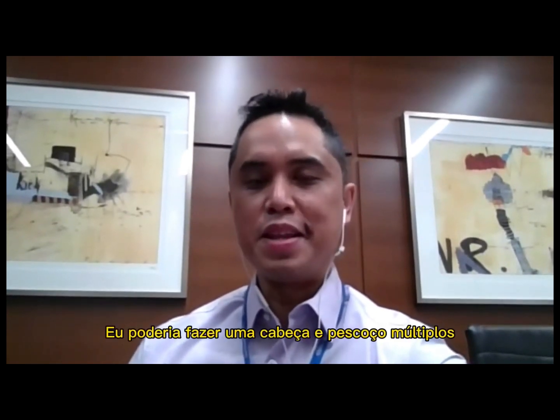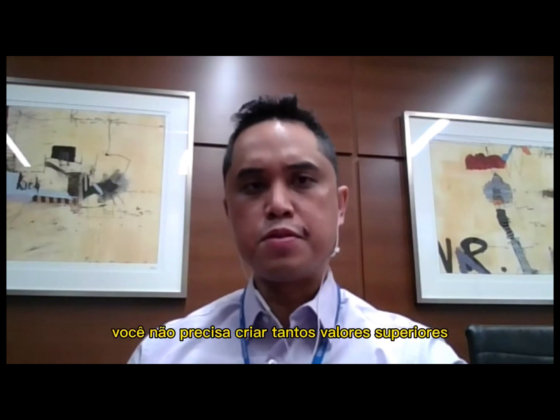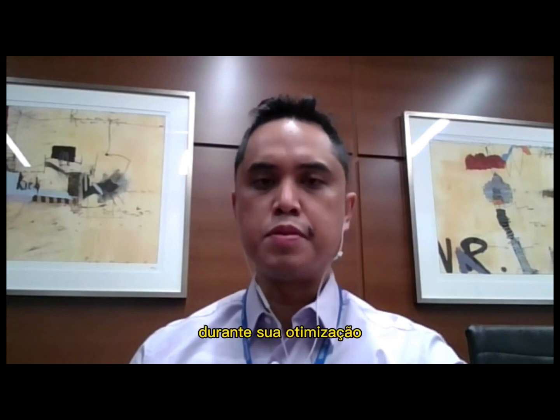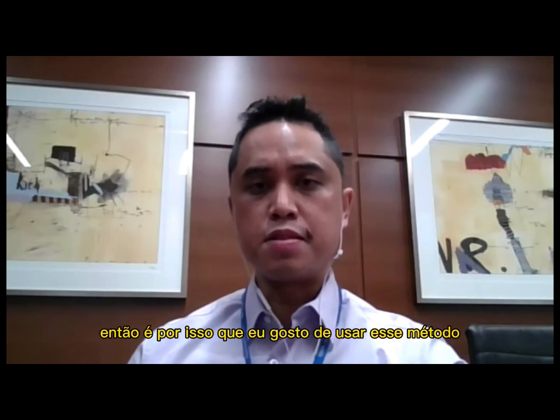I could do multiple head and necks if that's the case using these GEUDs. The good thing about it is that you don't have to create so many upper values during your optimization. I could put 3 or 4 and it will still get the same job done. So that's why I like using this method.